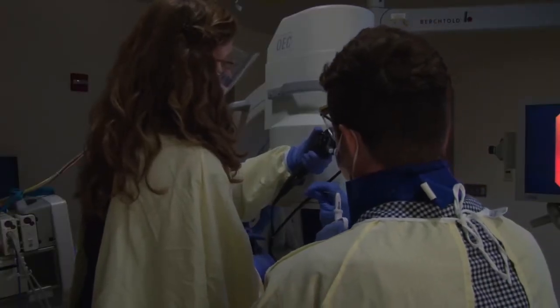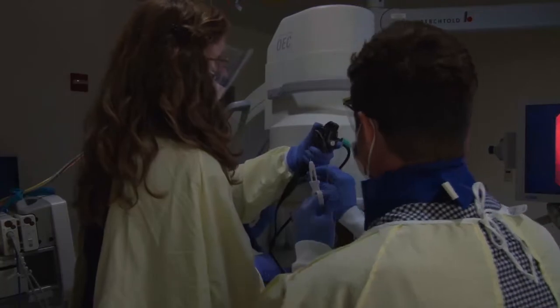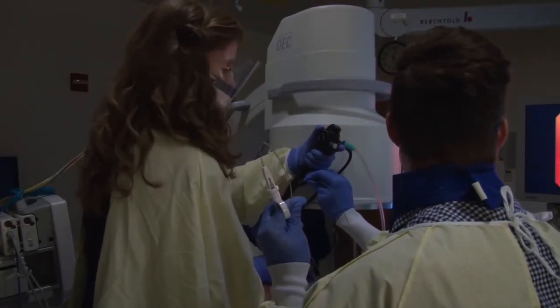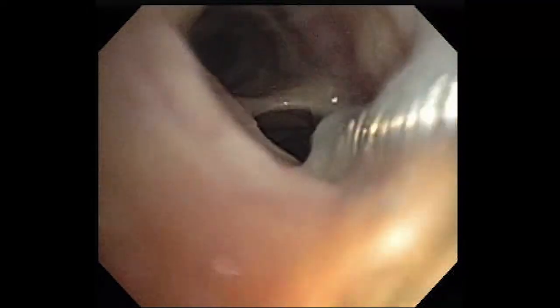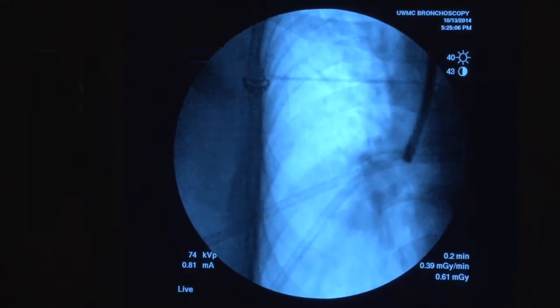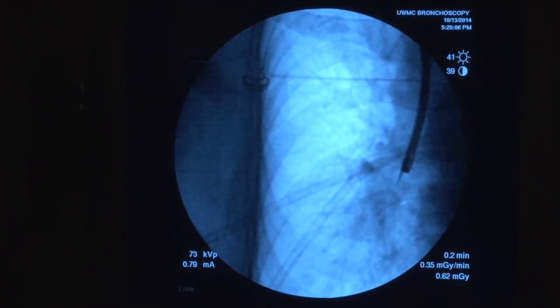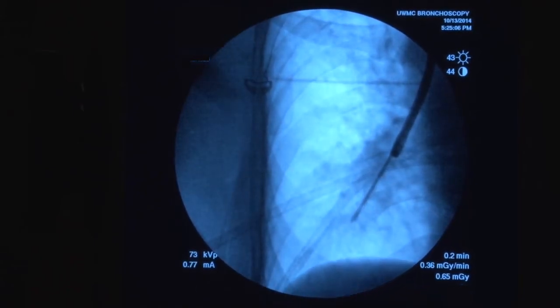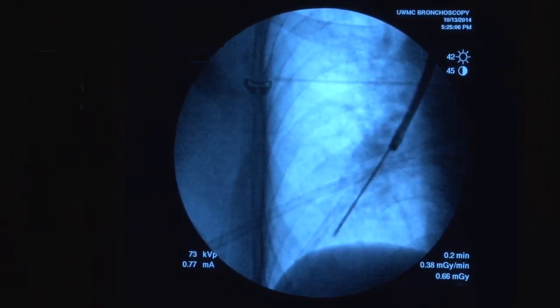Once you've maneuvered the bronchoscope to the right airway, insert the forceps into the working channel and watch the forceps enter the subsegmental airway of interest. Then turn on fluoro when you can no longer directly see the tip of the forceps. On the fluoroscope monitor, watch the forceps advance until you feel resistance or until the tip of the forceps are within a couple centimeters of the chest wall or appear to be within the mass.